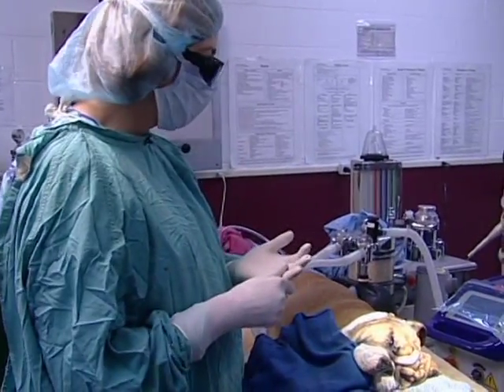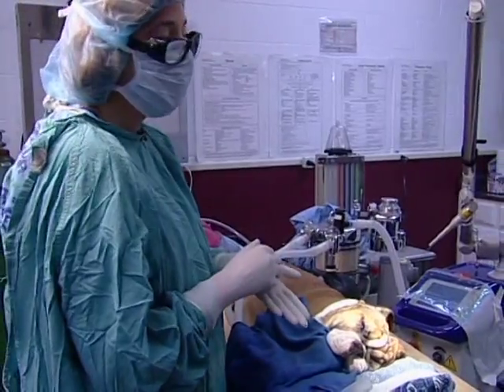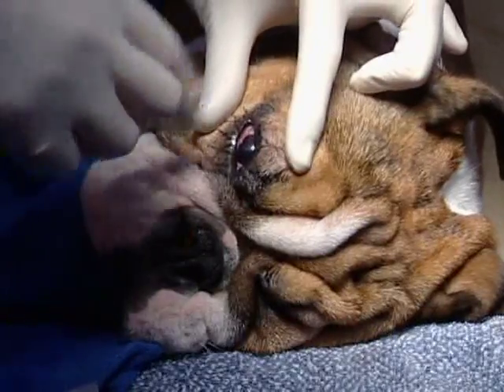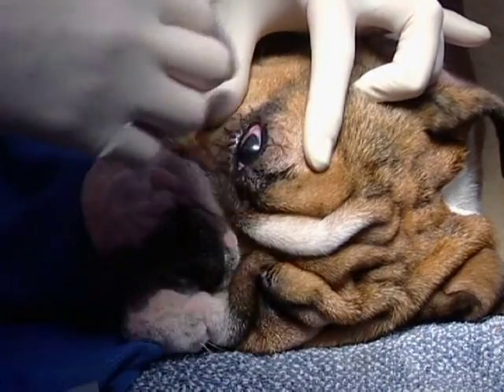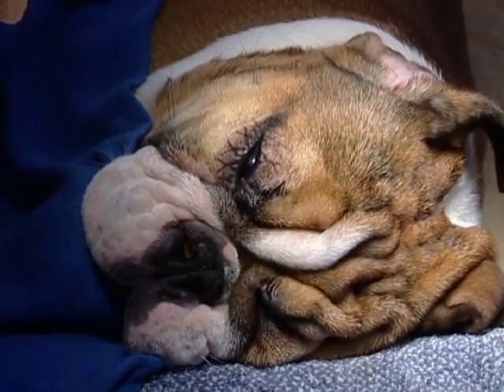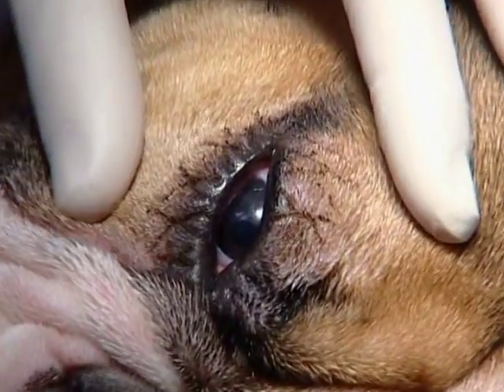The laser difference — a cutting edge difference — is having an instrument that will allow me to correct what was a very bloody procedure. With a laser, this is unheard of with the scalpel. You just cannot control your cut to be partial thickness through the dermis, so you can't even do this. Plus, the laser is what's contracting the skin and collagen, causing this reaction. This is impossible with the blade, only with the laser. It corrects many mild entropions.